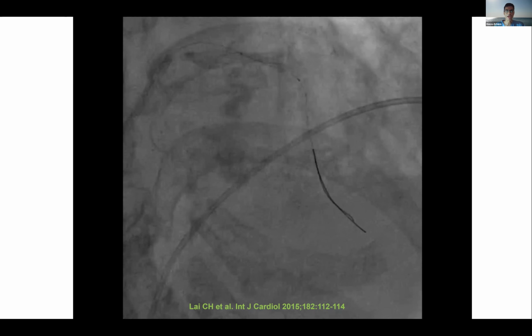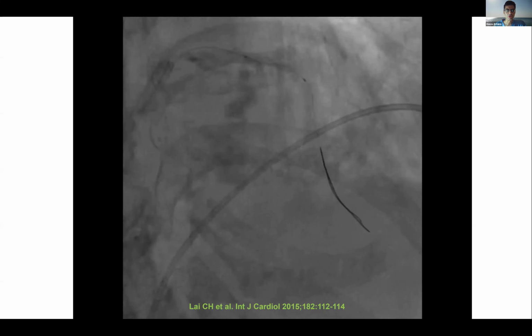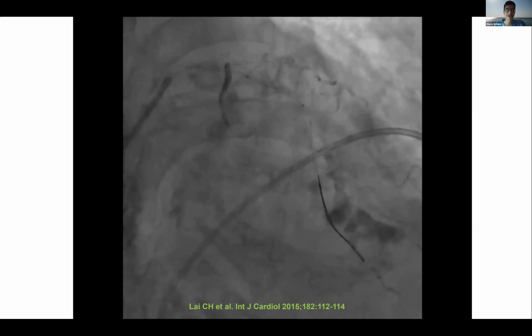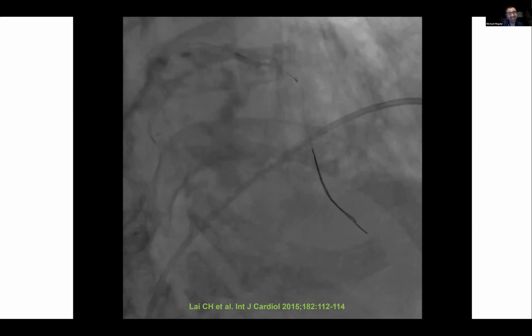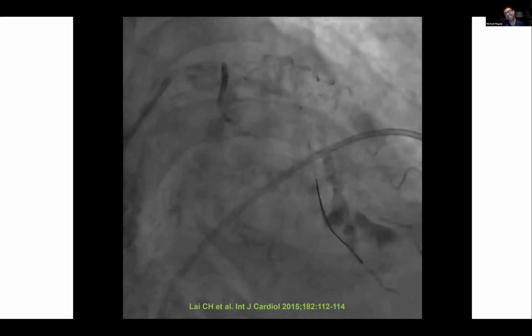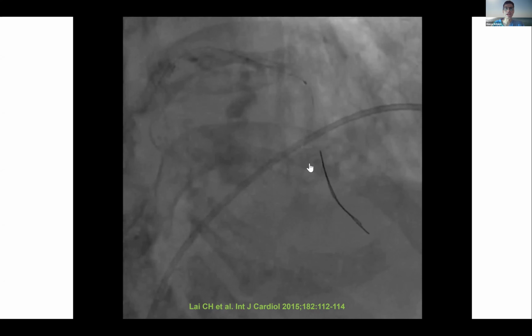Yeah, absolutely. And I think this is the case where, are you going to do the covered stent here? So you ask the question? I guess you don't have to ask the question, right? You also call the surgeon just in case. Absolutely. I mean, this is the one, actually, you call the surgeons right away. Looks like they have a buddy wire now.